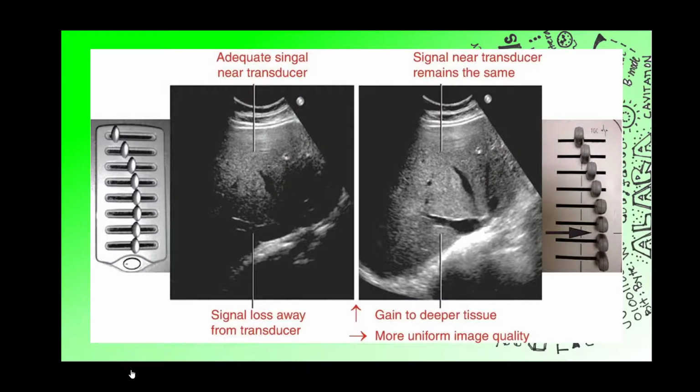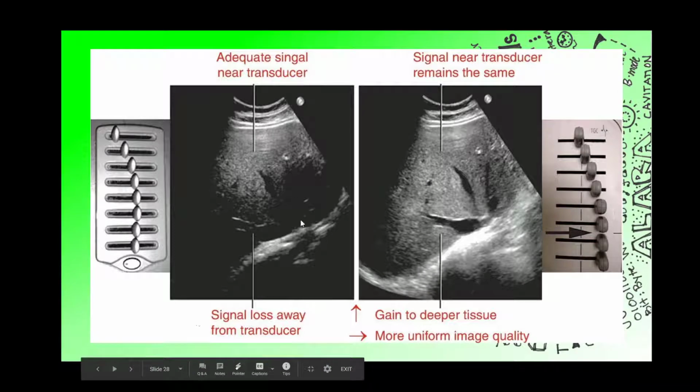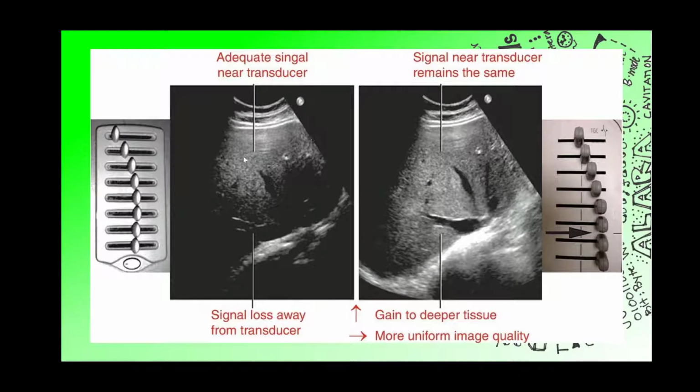So again, another example, we have an image of a liver here. Our image in the near field looks very nice. We can see all the structures, but now we've attenuated in the far field and can no longer see the liver structures. So what we need to do then is slide our TGC knobs to the right to make that far field brighter, and then we will assign the correct echo brightness to that far field to make the picture appear uniform.